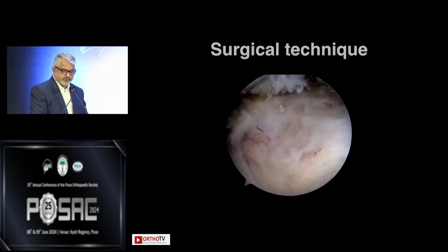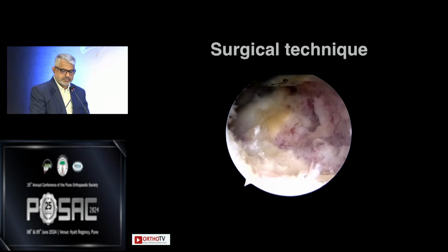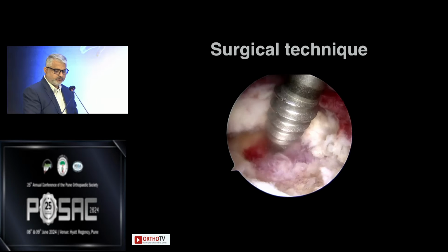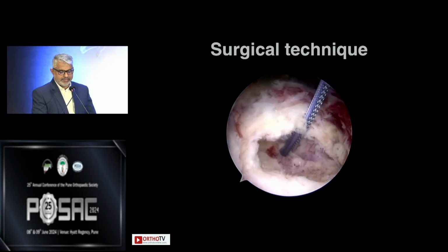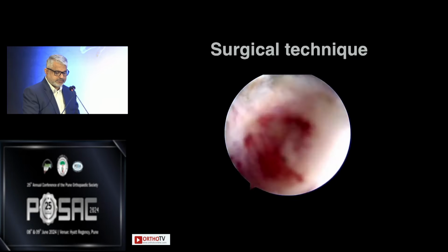You're going to clear off the fracture hematoma, debride the base of the fracture, and you're going to assess the geometry. That's the junction of the articular cartilage and the crater. That's where my first anchor would go in. And then you're going to start passing the sutures.